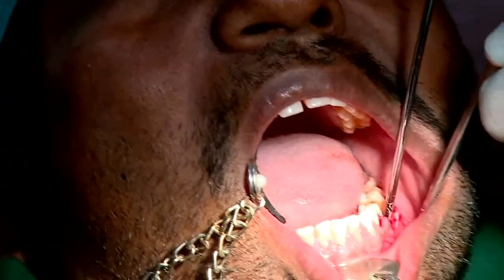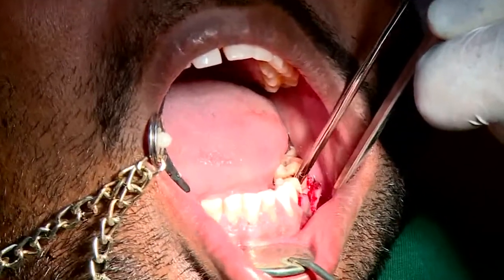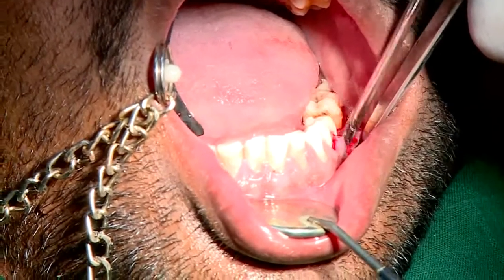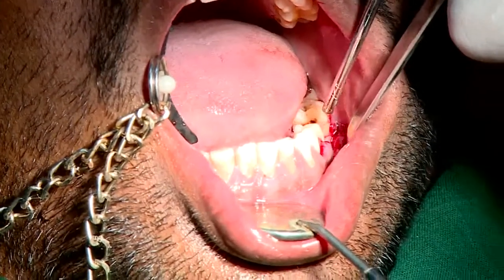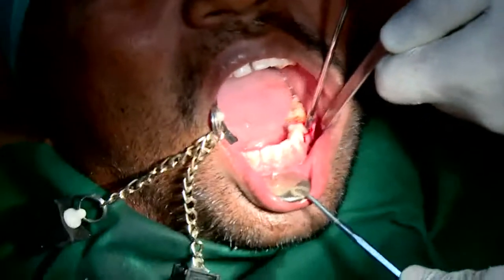See, normally the requirement is you need to have a minimum of 1.5 millimeter of bone on all sides of the implant. So for a 4 millimeter implant with bone all around, you need a crestal width of ideally 7 and above.